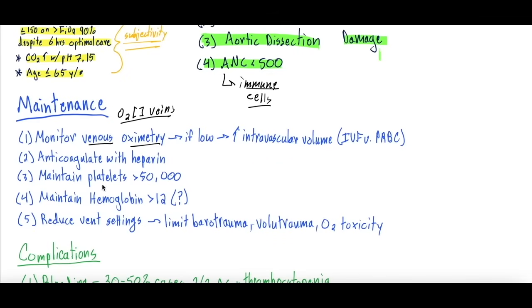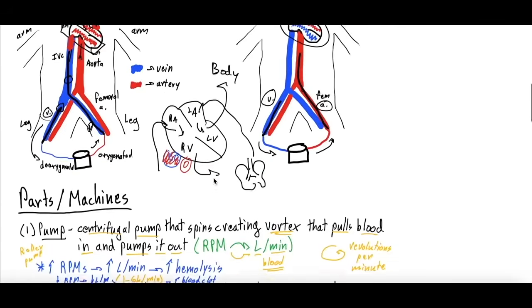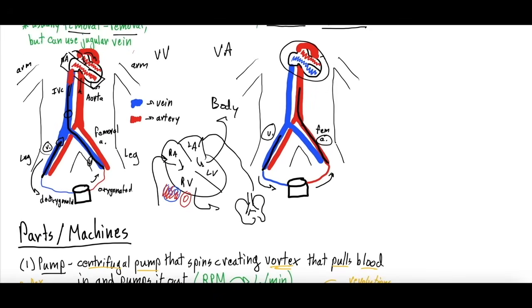All right. In addition to that, as we've talked about, you need to anticoagulate these patients with heparin. Heparin, right, is a medication that we often use for both treatment and prevention of blood clotting. It is a common medication, but the dosing you need to use in ECMO is quite high. As you can tell, patients on an ECMO circuit, and we're going to scroll up to go back here, you're pulling blood out of the body and putting it through this circuit. This is very high risk to be prothrombotic and cause blood clots to form, right?